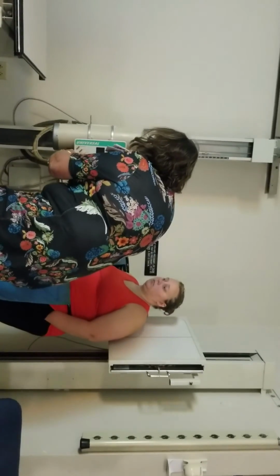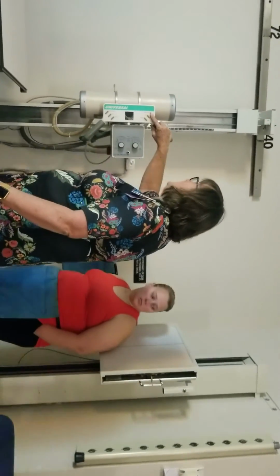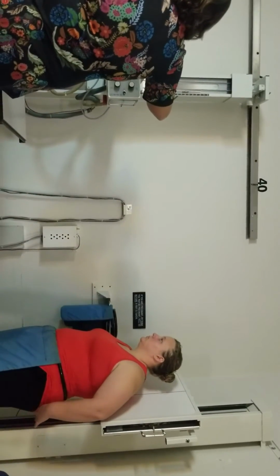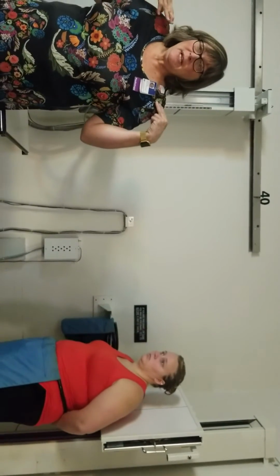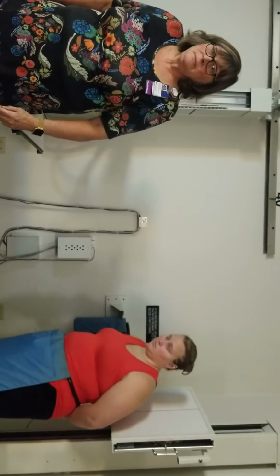Remember we talked about the beam divergence, so I'm going to back up my tube to 72. Now when I back up my tube to 72, I wanted the beam divergence, but what does that do to the intensity of my X-ray beam? Lessens it.